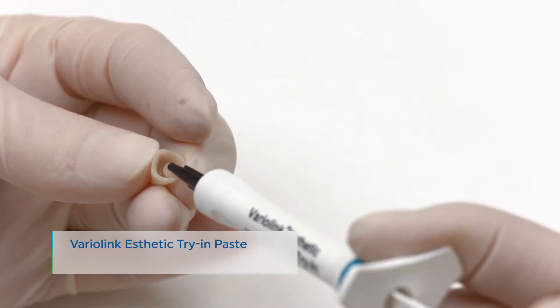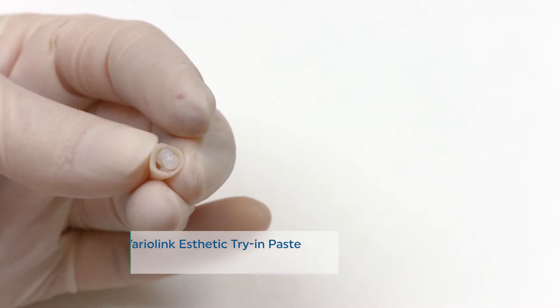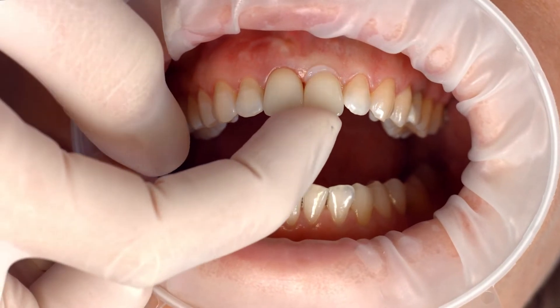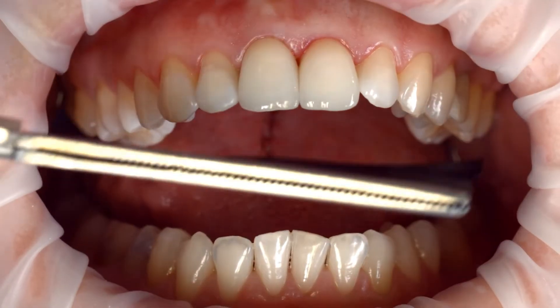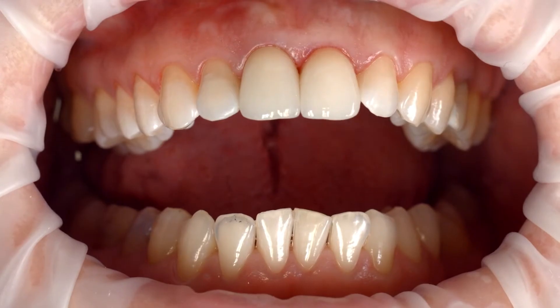For optimum aesthetic results, use Variolink Aesthetic Try-In Paste to evaluate the shade of the restoration. When trying in the permanent restoration, check the shade effect, accuracy of fit, and occlusion of the restoration.